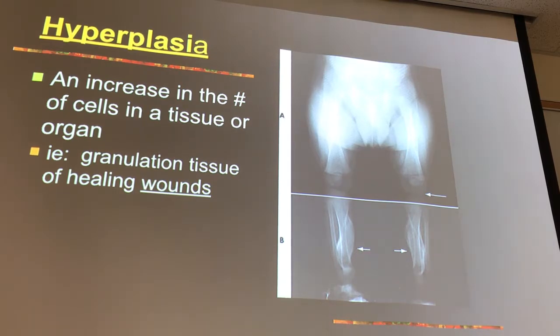It was not just a theory that Raphael and whoever else gave it to you just to stick on the shelf like you learned when you learned some other thing in school somewhere. This is something you're going to use every day without actually thinking about it. You're not going to go, 15% rule. No. You're going to go, ooh, she can barely walk in the room and looks very fragile. I'm going to lower my kVp. Well, you just did the 15% rule without bringing out the calculator. Does that make sense? All right. Does that answer your question?